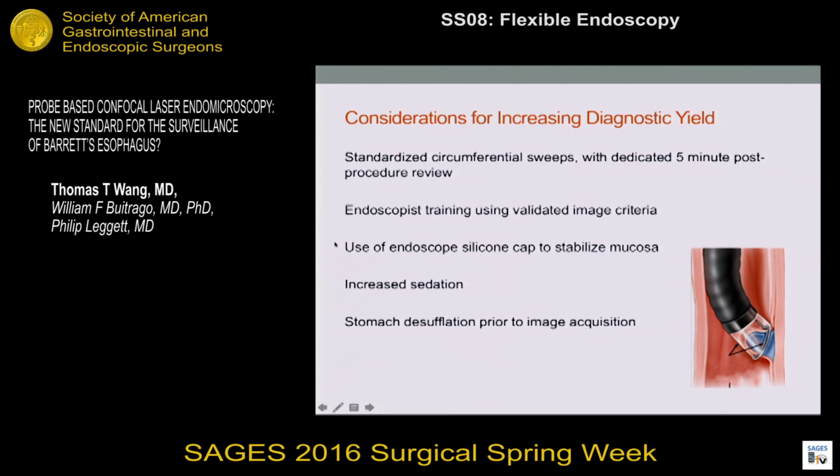And on the patient side of things, we've started to use a silicone tip to stabilize the mucosa when you're deploying the probe to enhance and minimize image artifact. And along those lines, sedation and stomach desufflation also tend to help decrease motion artifact for better quality of images.